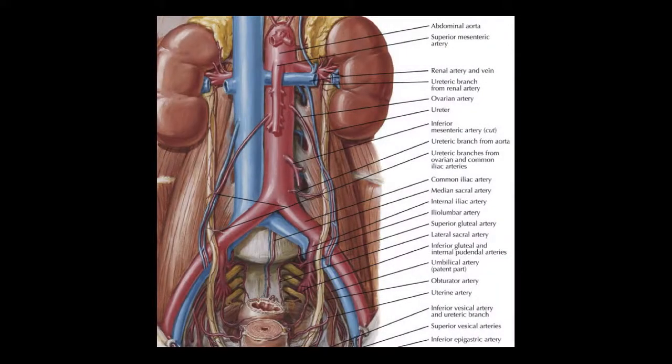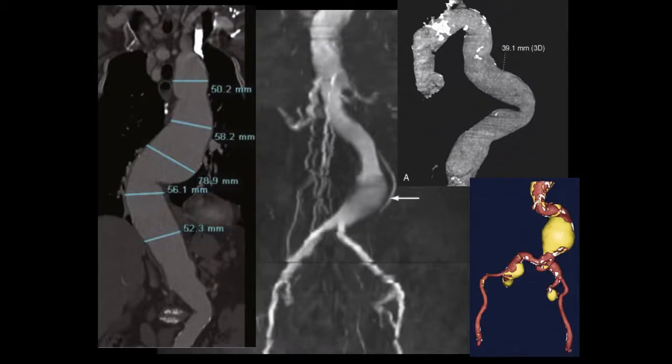When I'm doing this scan, I pretty much only do a transverse exam. You can do a longitudinal, but I just like the transverse better, and here's why. Most of the aortas we see are not going to be nice and straight and narrow. Most of the aortas we're evaluating for pathology are going to look very curvy and very tortuous, and trying to get a good longitudinal image is going to be very difficult, if not impossible.